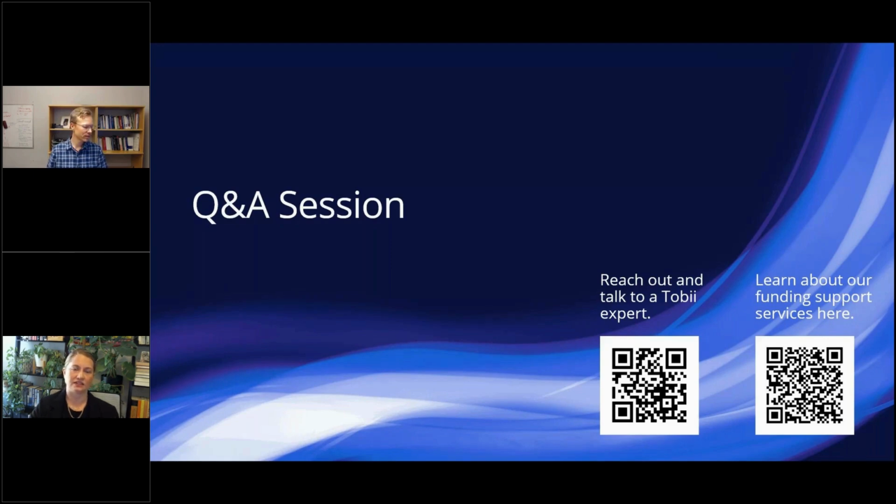That's great. And even in the data that you showed, the blink duration with the eye openness signal versus the pupil signal was a bit longer. What more can you say about the robustness and the accuracy of using the eye openness measurement versus the pupil diameter? Well, I think it makes perfect sense that the eye openness blinks are a bit longer, because the pupil, of course, does not know about the eyelid movements. You can only tell that the eyelid moves when it covers the pupil. So it makes complete sense that the pupil size blinks have shorter durations than the eyelid blinks, simply because the eyelid could start moving before it occludes the pupil. Yes, it seems like it is a more robust and possibly accurate measure of not only the duration, but also these eye blink dynamics. Yeah, it's a direct measure.